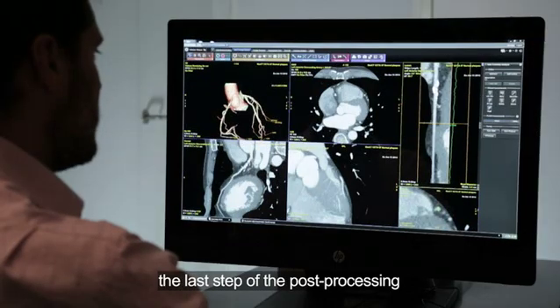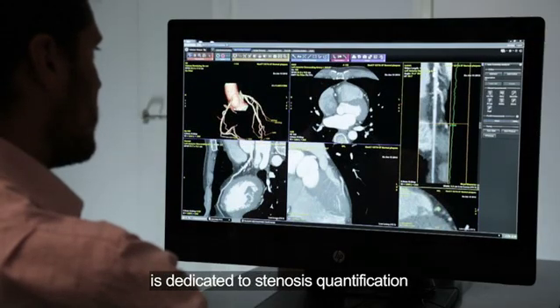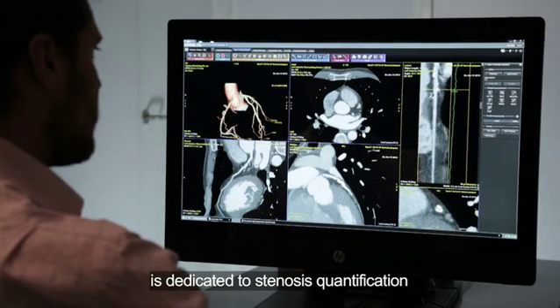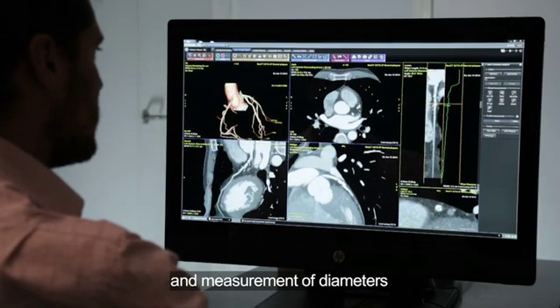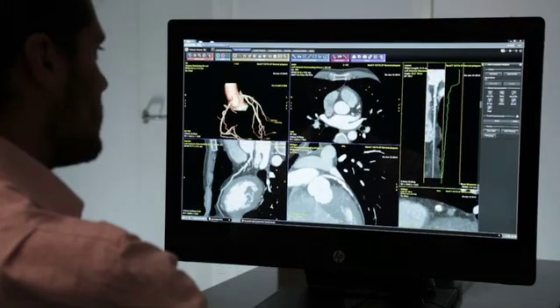Part of the post-processing is dedicated to stenosis quantification and measurement of diameters and size of the vessels.